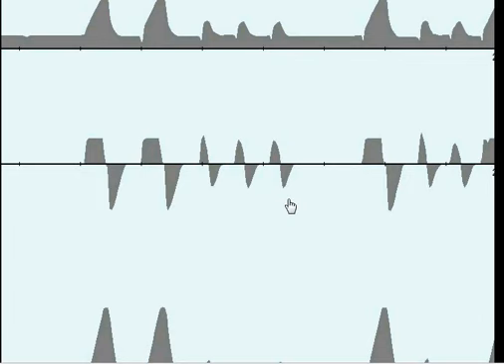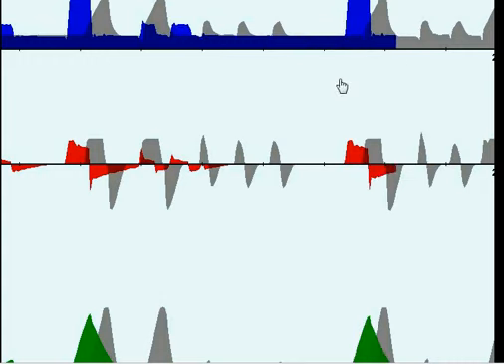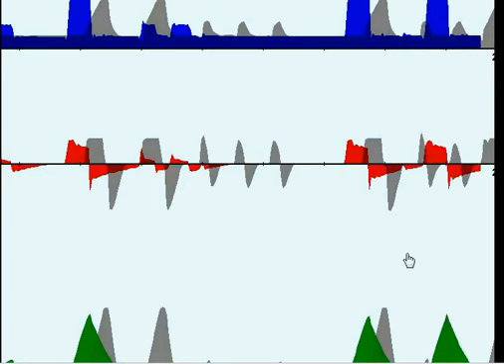And I'm just going to gray this out to show the contrast between the IMV breath phase and what's going to be the Pmax, which is going to happen with changes in compliance and resistance. So this next breath series is the mandatory breaths hitting the Pmax level, as indicated by this breath shown by my pointer. However, the spontaneous breaths haven't met my Pmax threshold. However, the mandatory breaths have. So my mandatory breaths that started as volume controlled breaths are now pressure control breaths.